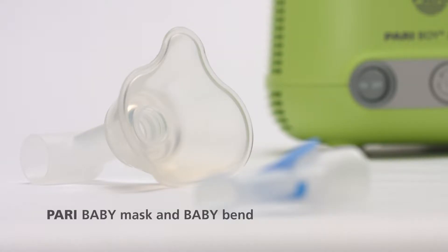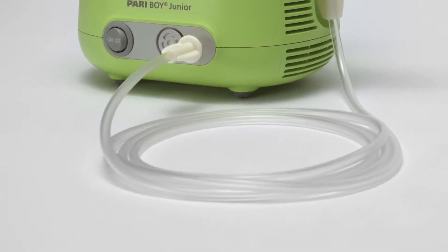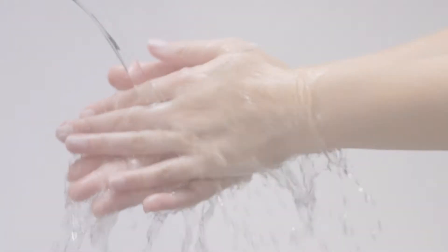Accessories include the Paribaby Bend and baby mask for babies and infants up to three years old, and the PARI mouthpiece with valve system for children aged three years and older. The long connection tubing allows for more freedom of movement.